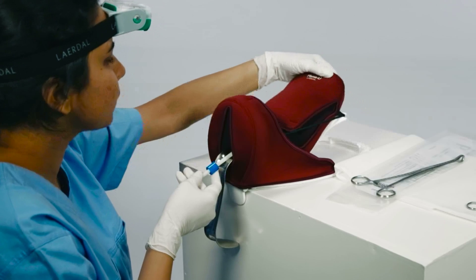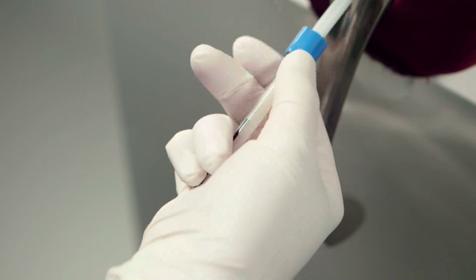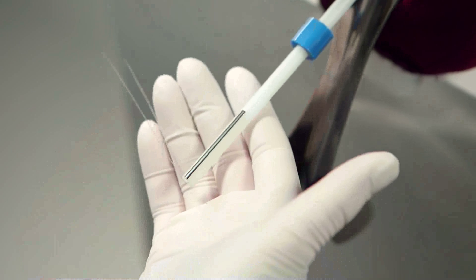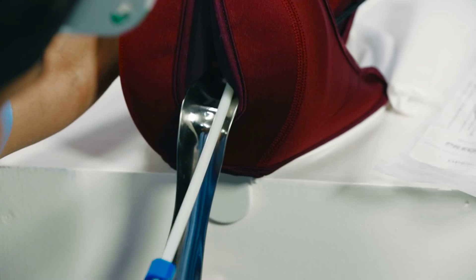Confirm that the IUD has reached the fundus. Move the flange upwards to release the threads. Make sure the threads are completely free before removing the inserter sleeve. Maintain the position of the uterus by pressing on it as you remove the inserter.